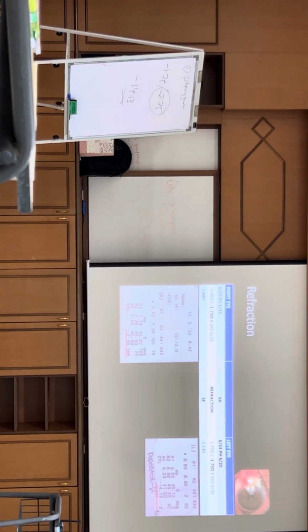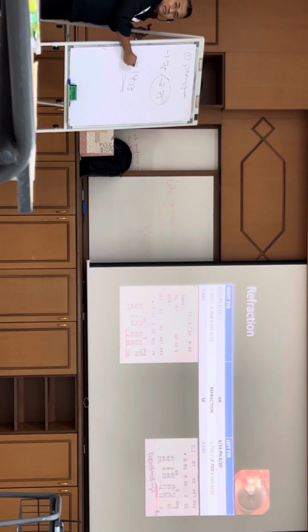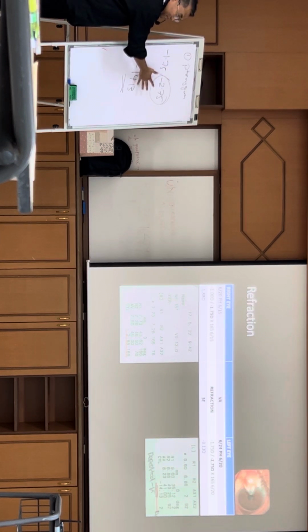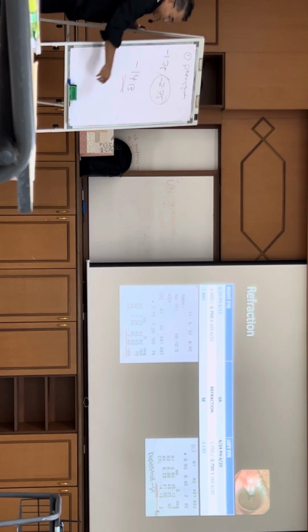If you are the technician doing this, you know that something is compensating this aspect. Something is compensating this aspect, because if the lens doesn't have a compensatory mechanism, it should be something like this. It should be high. At least you know that. Okay, this aspect, because we haven't removed that. This one we haven't removed that. So now at least at that particular time, you have in mind that whatever astigmatism we have from the cornea is now being masked by your lens. Understand, yeah?